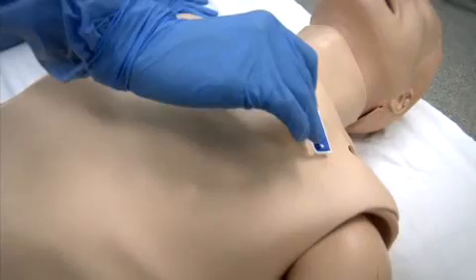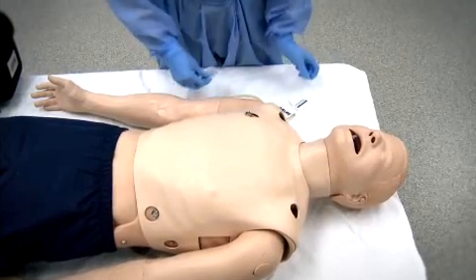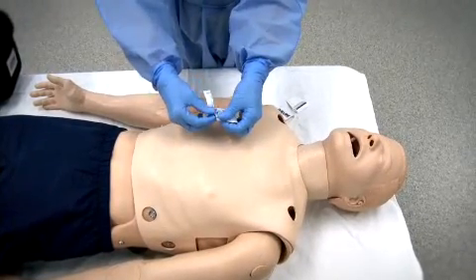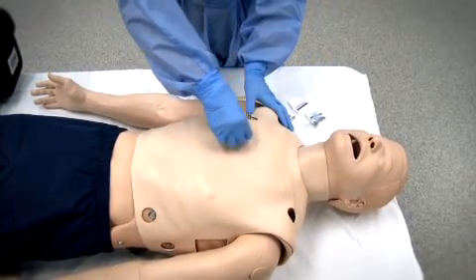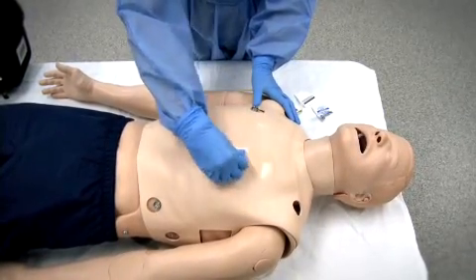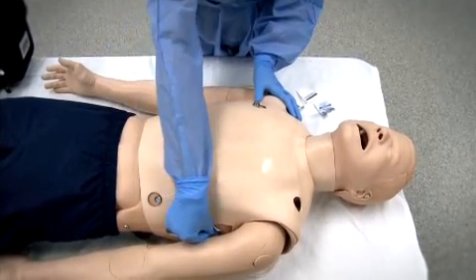The accuracy of the ECG tracing is affected by many factors, including the quality of contact between the monitoring electrodes and the skin surface. Similar to applying defibrillation pads, prepare the skin surface of the chest, if necessary by thinning chest hair and wiping away sweat to ensure adhesion of the electrodes.